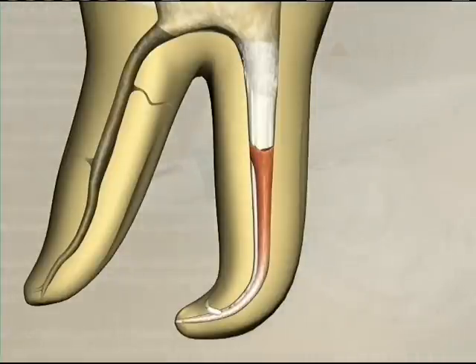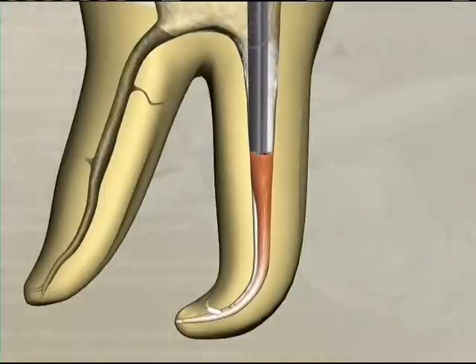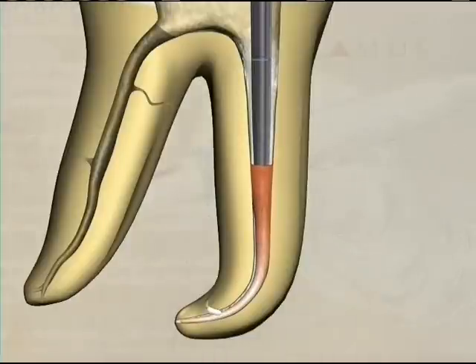Some gutta percha will stick to the cooling instrument as it is removed. A pre-fitted plugger is introduced to compress the gutta percha that has remained in the canal space. This plugger is worked around the canal to push the gutta percha down and compress it into nearby lateral canals and anastomoses. The plugger is then held on top of the gutta percha mass for about 5 seconds as it cools.